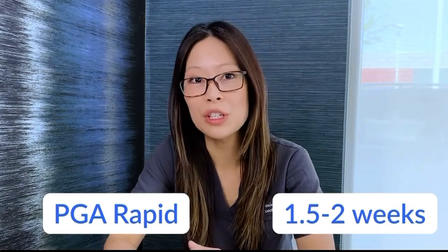For a faster absorbing synthetic thread, you can choose PGA Rapid, where the absorption time is approximately half of that of normal PGA. Monocryl is an absorbable thread that deserves a special mention. This is a monofilament thread with advantageous handling properties. The tensile strength is comparable to PGA, and the main advantage of monocryl is that the soft tissue reaction is very gentle. And as you use it, it glides through the tissue quite smoothly without pulling it.